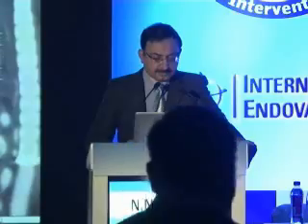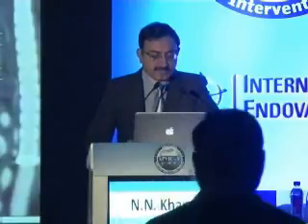So this is the completion intracerebral angiogram, which shows that the patient was fine on the table. There was no distal embolism in any of these branches. This is a follow-up CT scan showing good positioning of the stent. And we discharged the patient on the third day on aspirin, clopidogrel, low molecular weight heparin, statins, and ACE inhibitors. In follow-up, there was no TIA or stroke, and we have followed this patient now for more than 3 years.